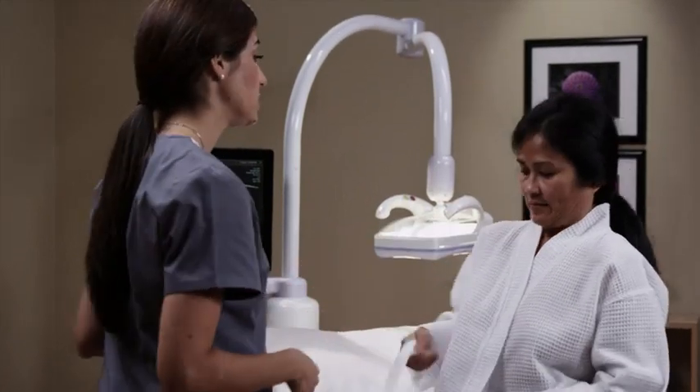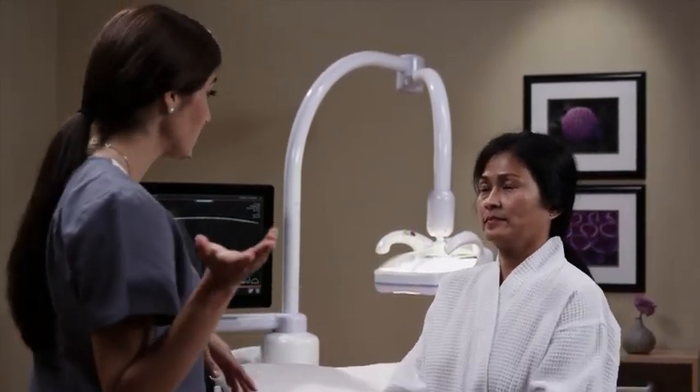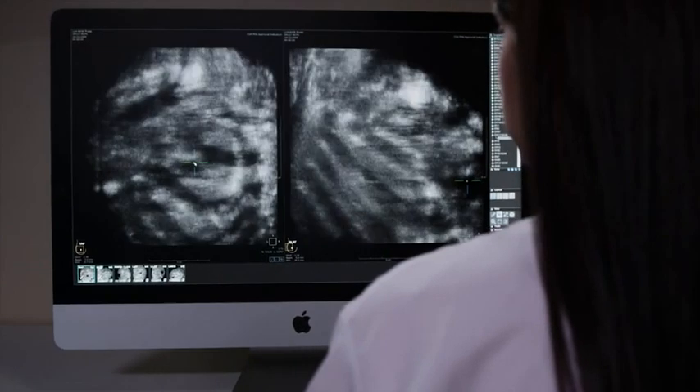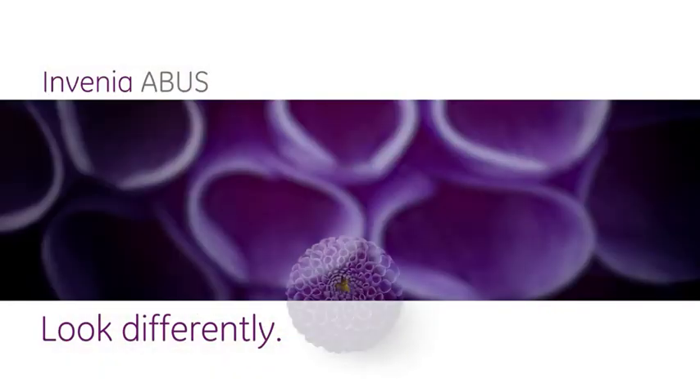After completing all the scans, the operator will verify that all the views have been obtained and will help you sit up and return to the changing room. Your findings will be evaluated by a radiologist and you will be contacted about your results. Invenia ABUS — helping physicians look differently at dense breast tissue.